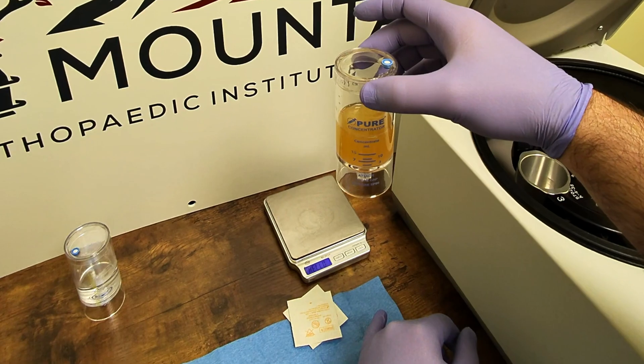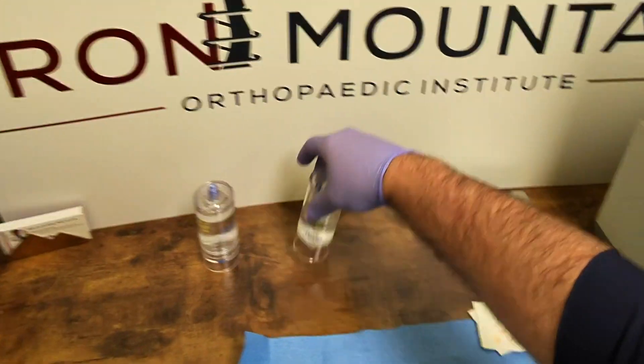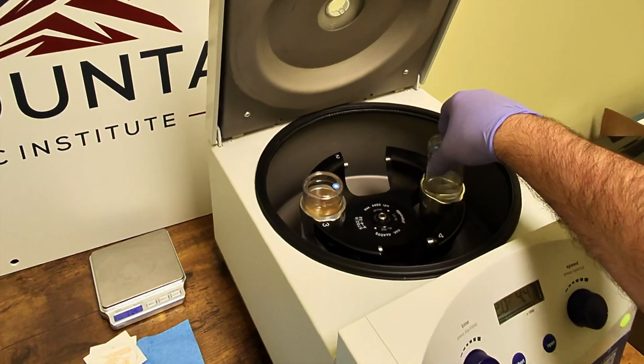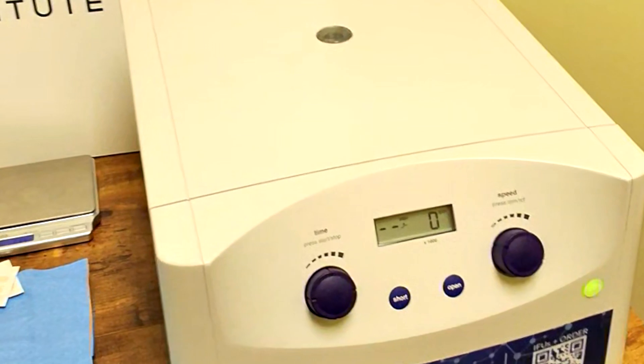The concentrator device is weighed and placed into the centrifuge with a counterbalance confirmed to be within 3 grams of the weight of the concentrator device. The second spin is at 4,400 RPM for 4 minutes.